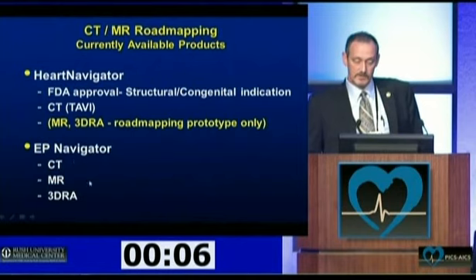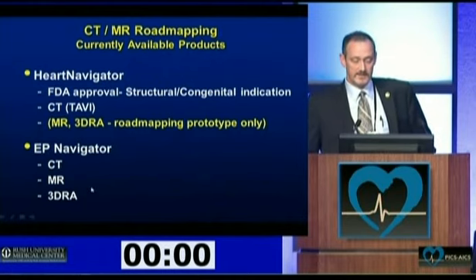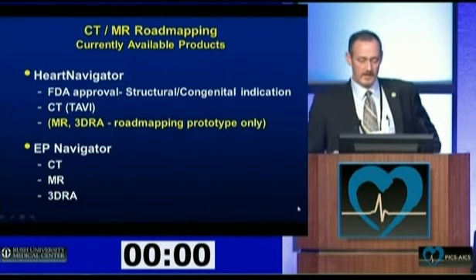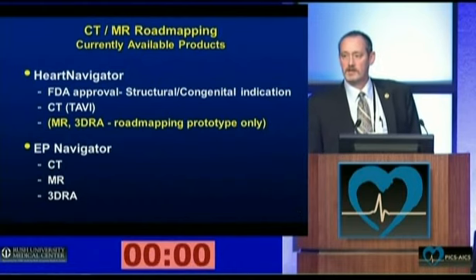EP Navigator was designed for electrophysiology work, especially imaging the left atrium for atrial fibrillation ablations. Right now that does have the capability somewhat of providing all three modalities of CT, MR, and 3D RA type of imaging for overlay.